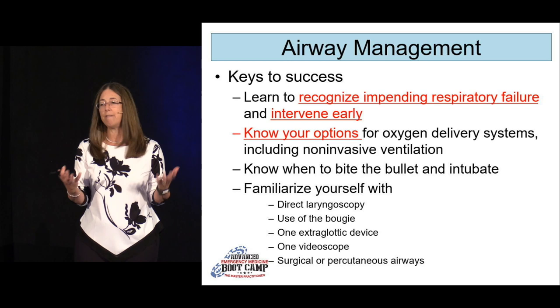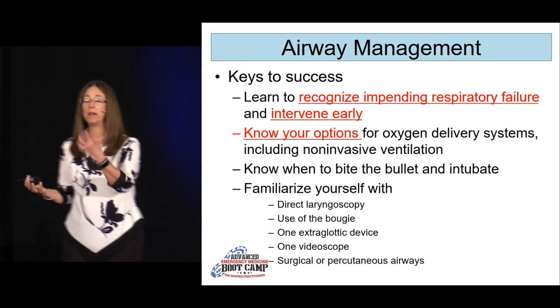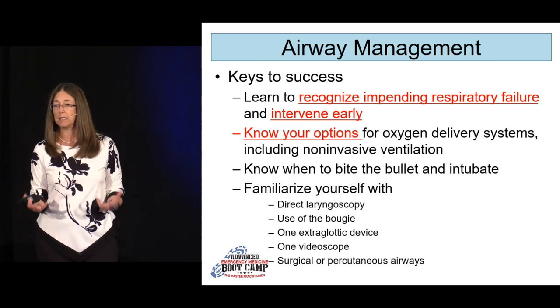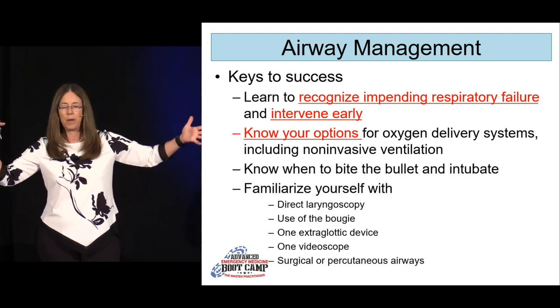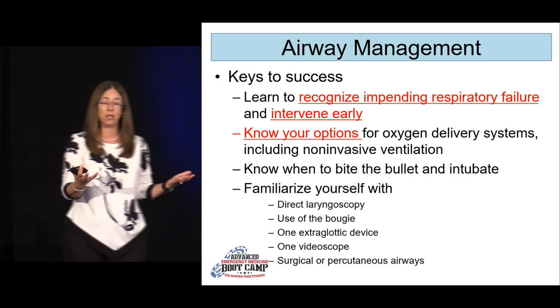If you want to get a higher FiO2 into somebody, you can take that bag valve mask with the face mask on it, put it on their face, and coordinate with their ventilations if they're spontaneously breathing. So you can go ahead and just as they breathe, you basically, because again, now that's a 100% reservoir, it's almost, not quite 100%, but close to 100%, where you can actually give them 100% FiO2-ish.